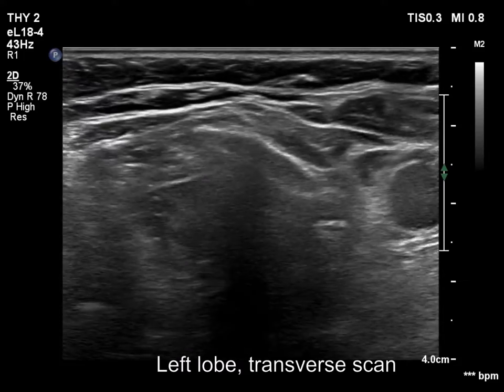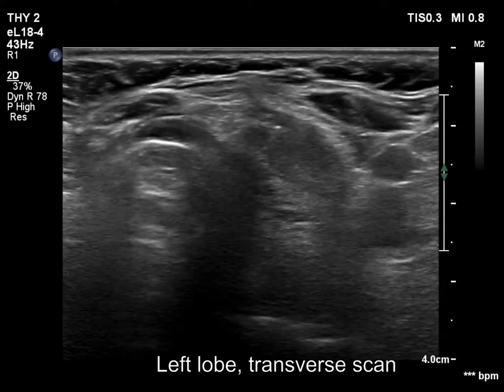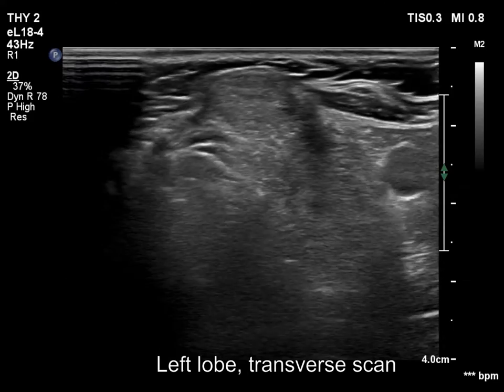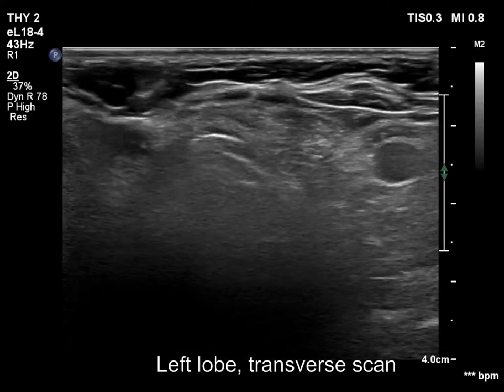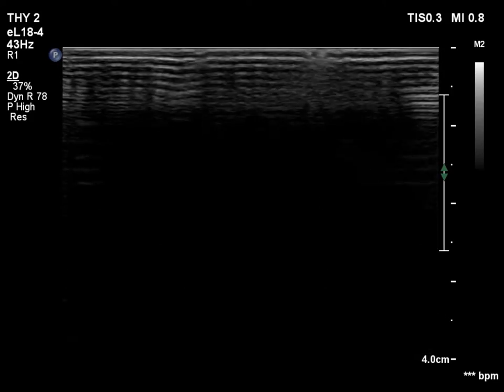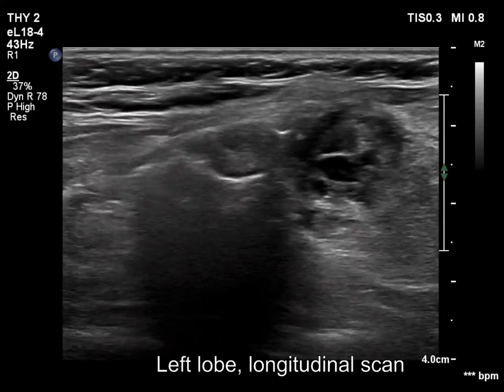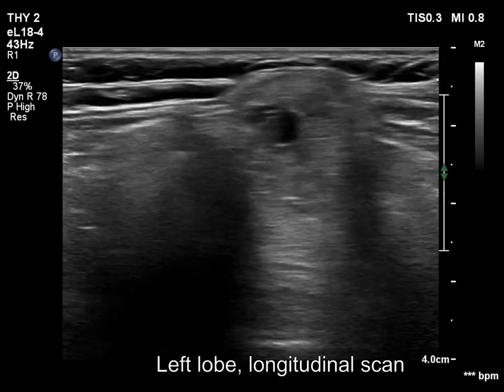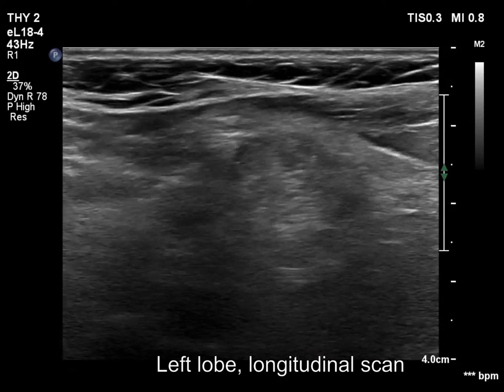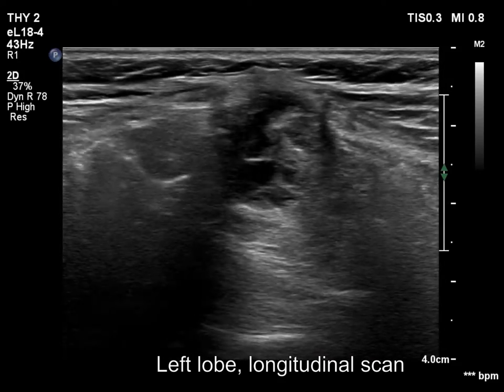The left lobe is composed of two mixed nodules. The ventral, dominantly solid nodule has a moderately hypoechoic solid part. The lower and dorsal is a dominantly cystic lesion. It is difficult to find normal, intact thyroid tissue.